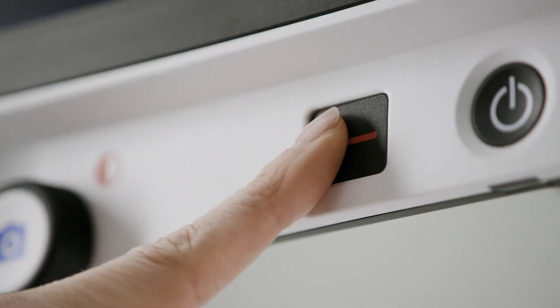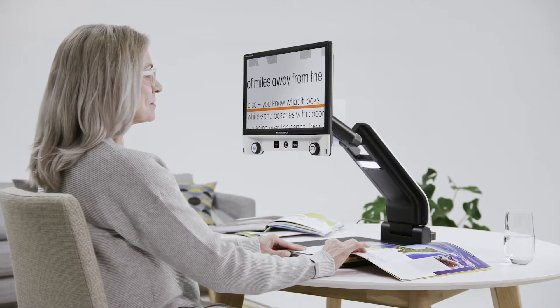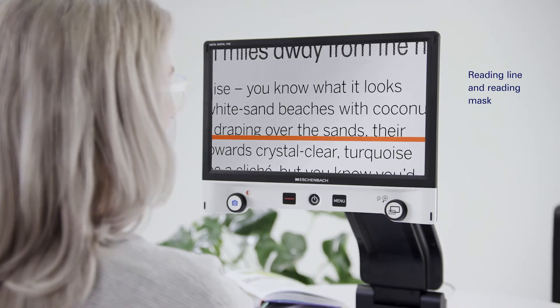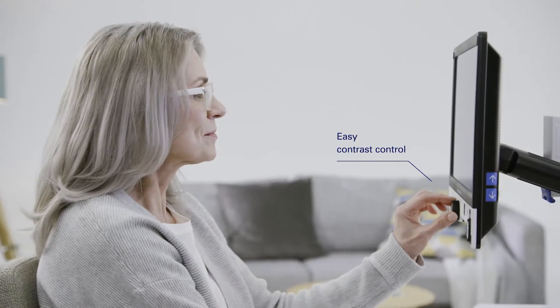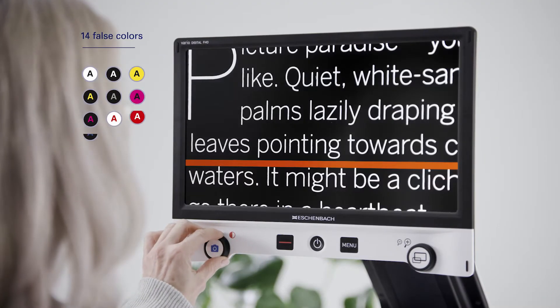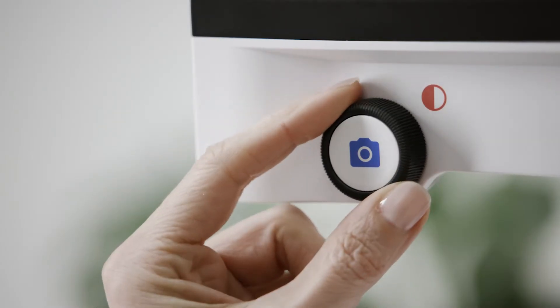Orientation guides can be switched on to achieve a better overview. These can be used horizontally for line alignment or vertically for column alignment. In order to increase the contrast of the displayed texts, there are 14 false color combinations which can be easily selected via a rotary knob.